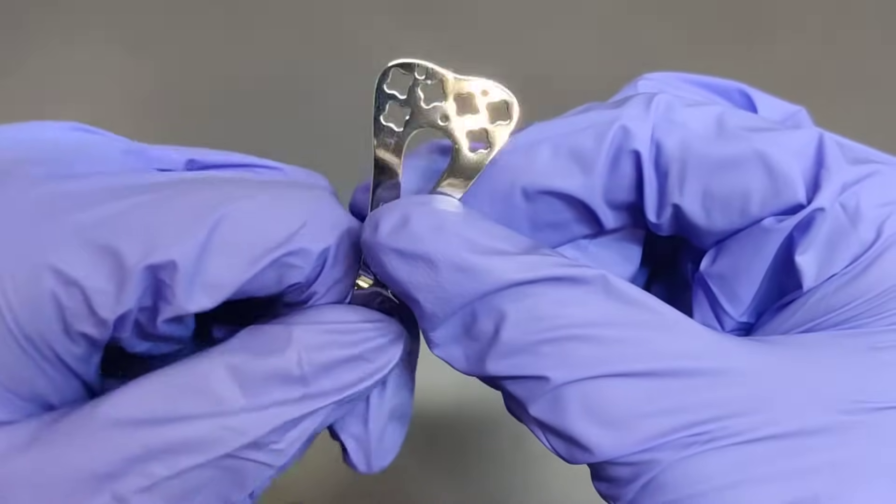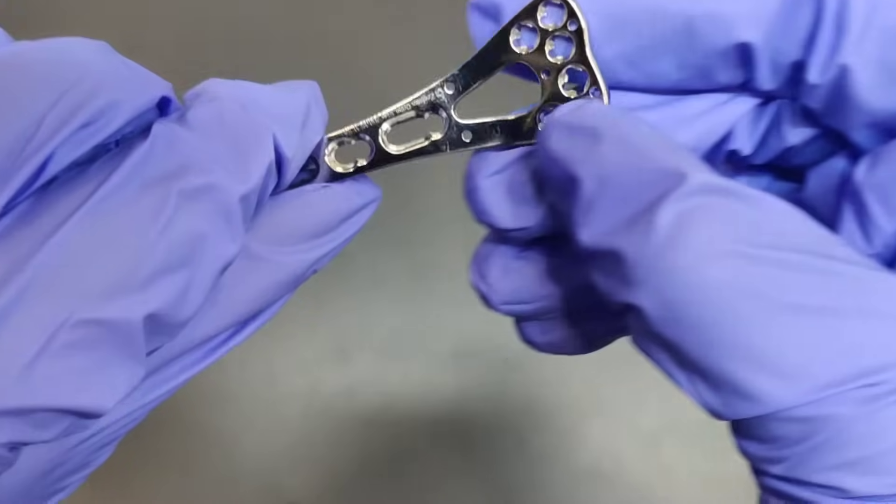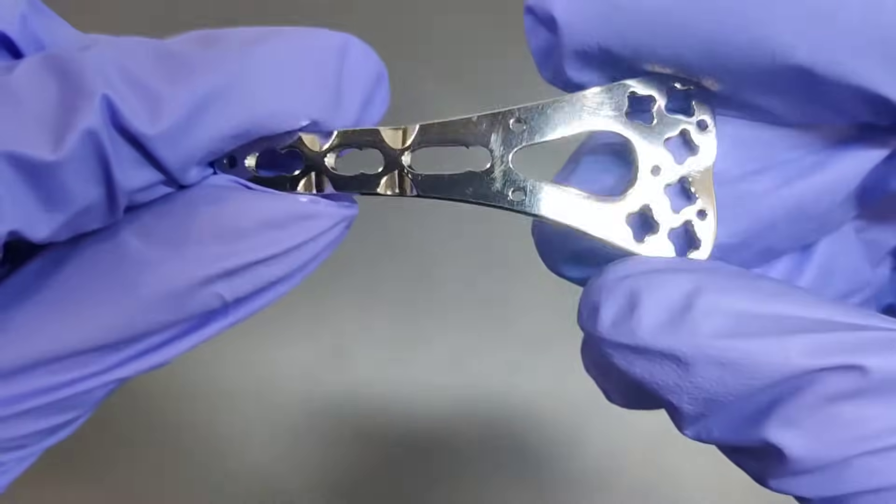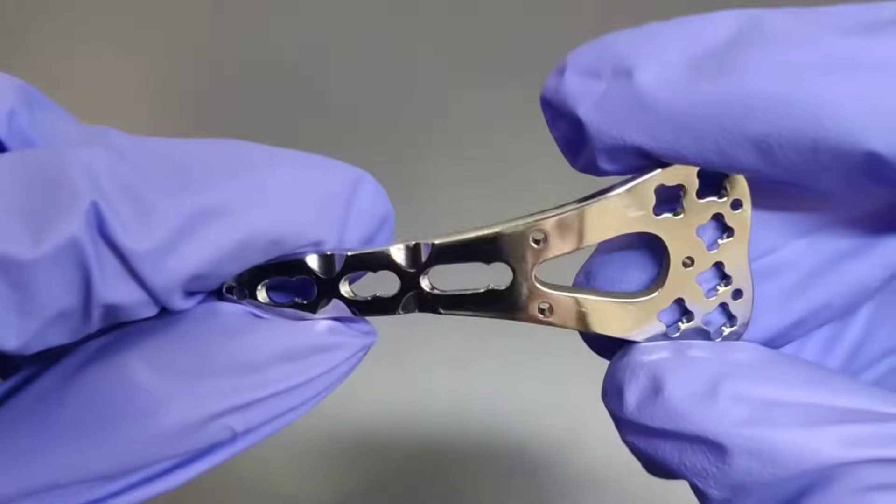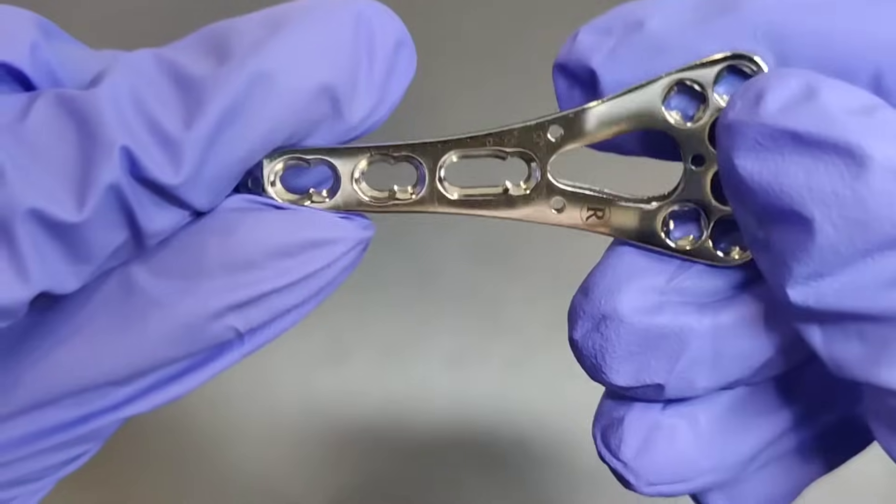Enhancing stability and support, the plates incorporate specialized screw holes tailored for fixation of the radial styloid, lunate facet and distal radio-ulnar joint.